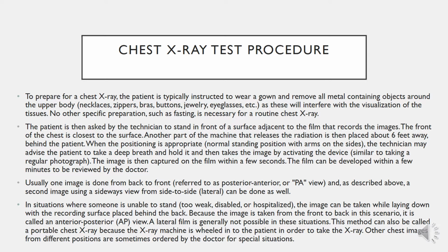This method can also be called a portable chest X-ray because the X-ray machine is wheeled into the patient in order to take the X-ray. Other chest images from different positions are sometimes ordered by the doctor for special situations.